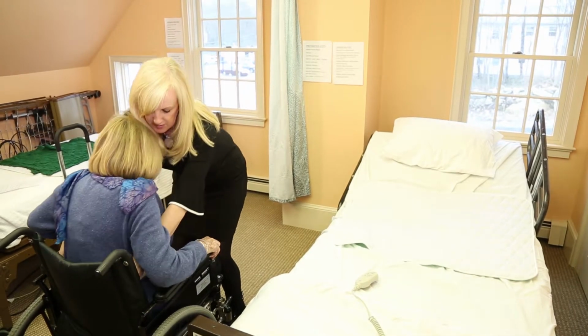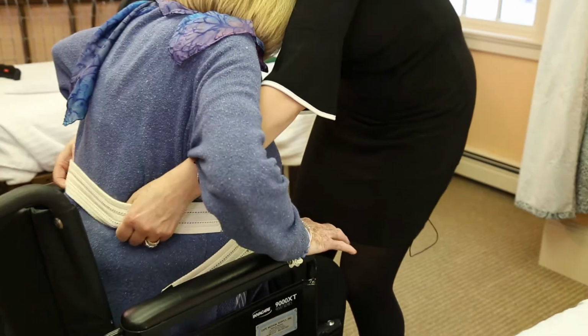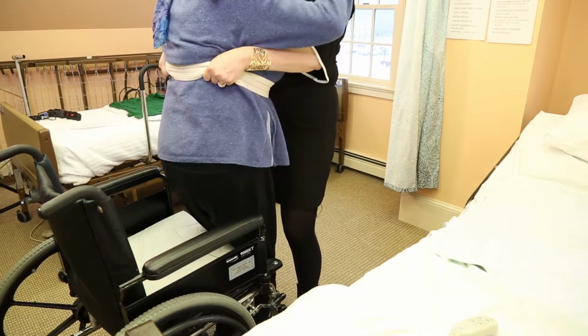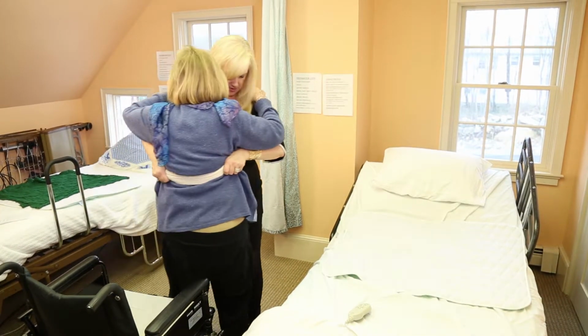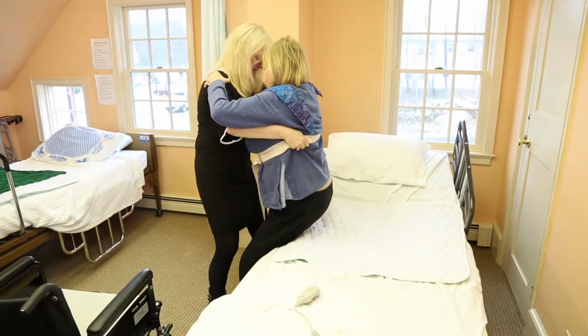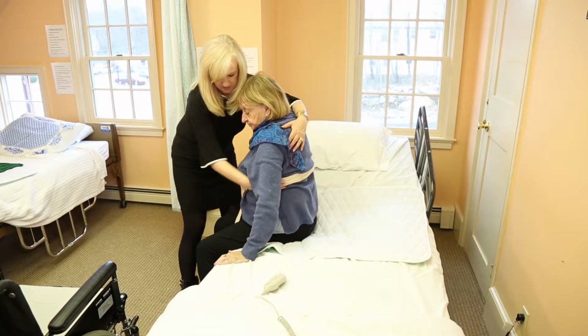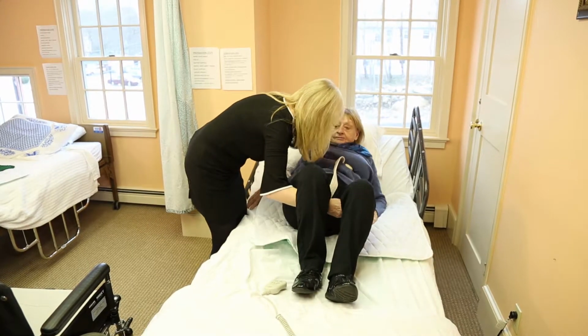Never let a patient grab you around the neck. Rock the patient 3 times in the wheelchair. Bring them to a standing position. Brace their knees with your knees and just pause for 1 second to make sure that they're not feeling dizzy. Then do the side step back to the bed. Swivel the patient's legs up on the bed, and that's it.